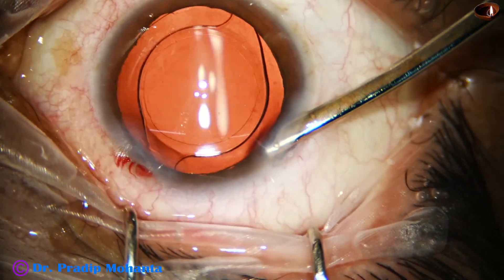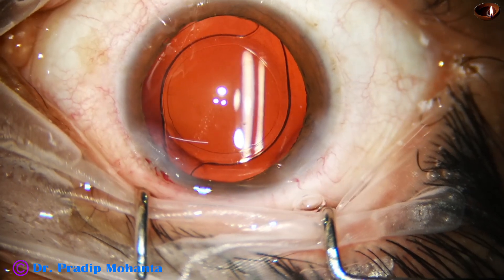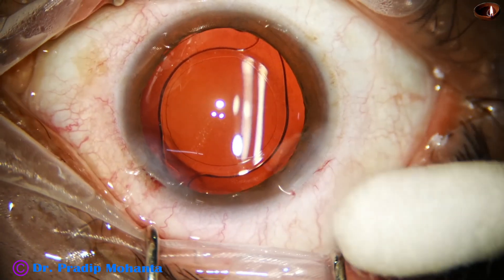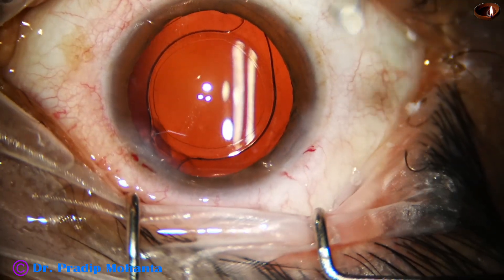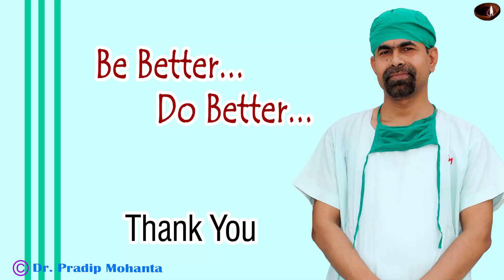Now the anterior chamber is nicely formed and the integrity of the wounds is checked. A few drops of moxifloxacin is applied over the ocular surface and the case is concluded. Thank you very much for your attention. Hope this video will encourage you to use Dr. Neto Rosatelli's long ball-tipped round-bodied chopper.